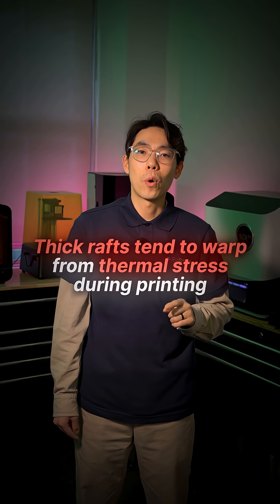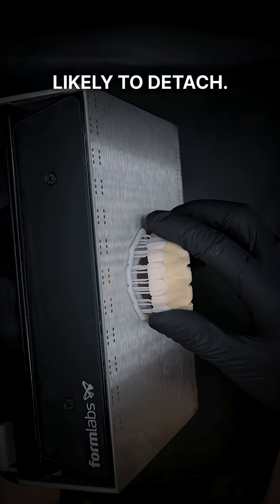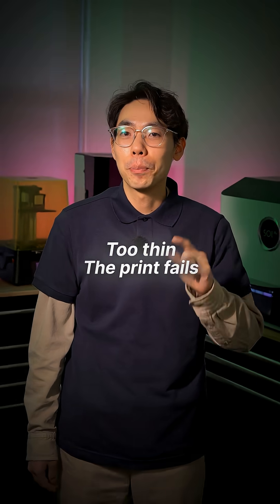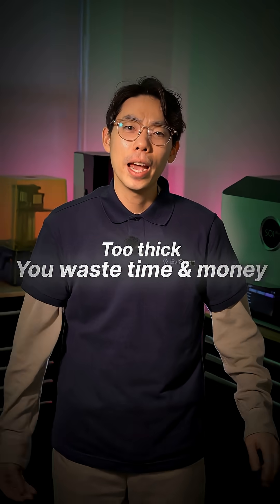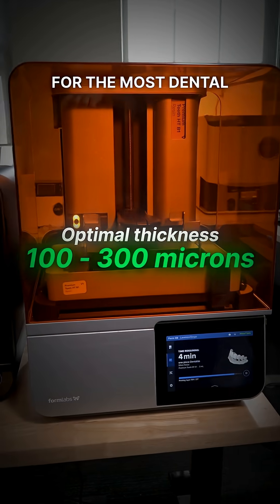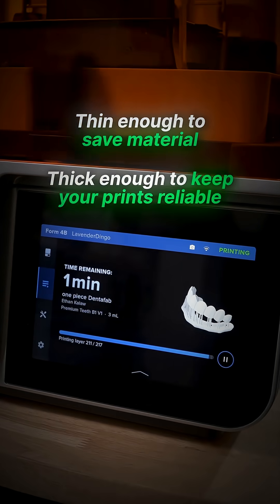Thick rafts tend to warp from thermal stress during printing and make your first layer more likely to detach. Your raft thickness presents a Goldilocks problem — too thin and the print fails, too thick and you waste time and money. The sweet spot is optimal thickness around 100 to 300 microns for most dental prints — thin enough to save material, but thick enough to keep your prints reliable.